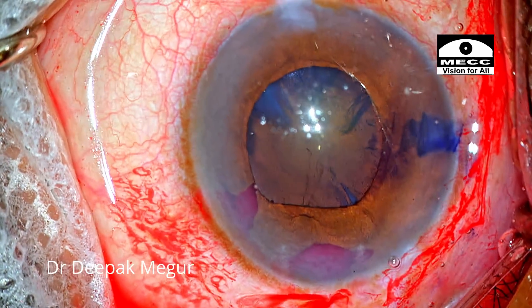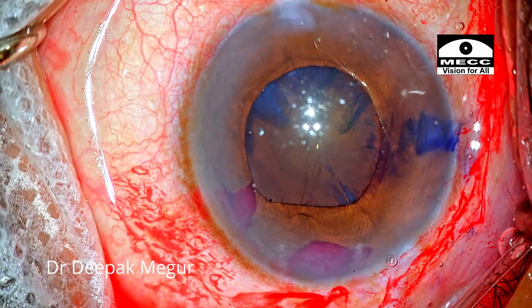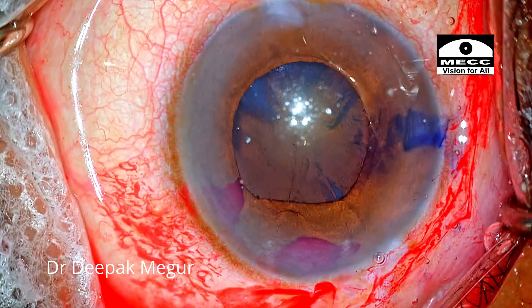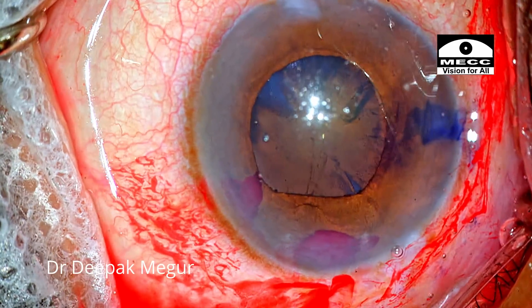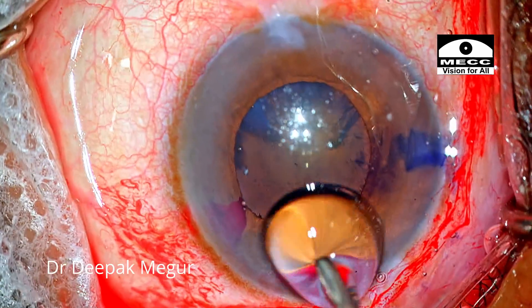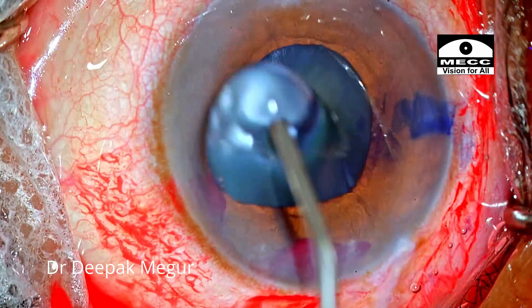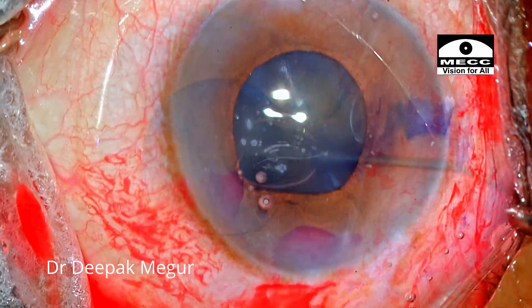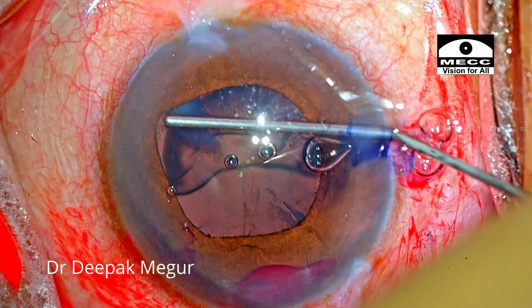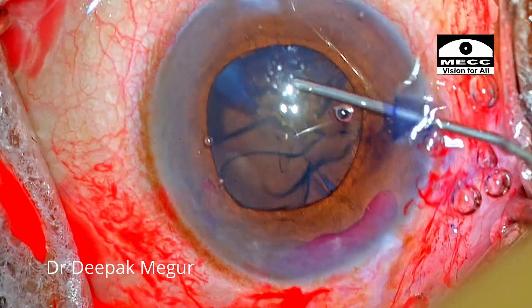I want a device to stabilize the floppy iris. I'm presuming this is a case of IFIS and planning accordingly — I just don't want to find myself in a more difficult situation mid-surgery. The capsulorhexis is still not yet done, so this is the right opportunity to use a B-hex ring as prophylaxis. It's not compulsory, but to be on the safer side I thought I would use it.